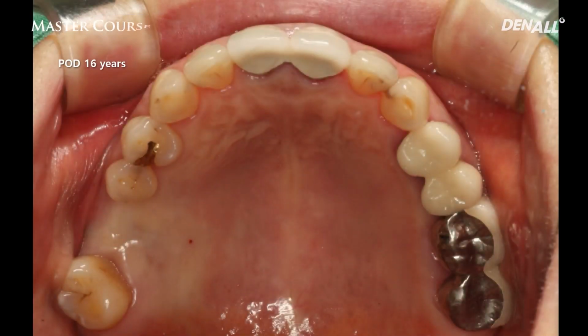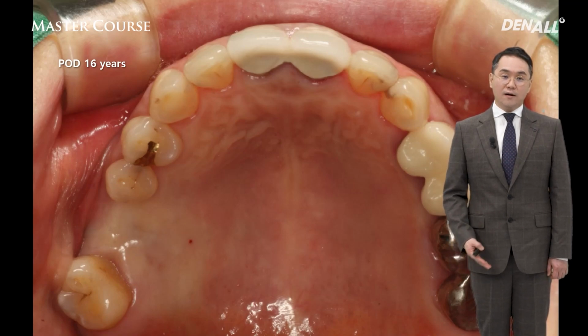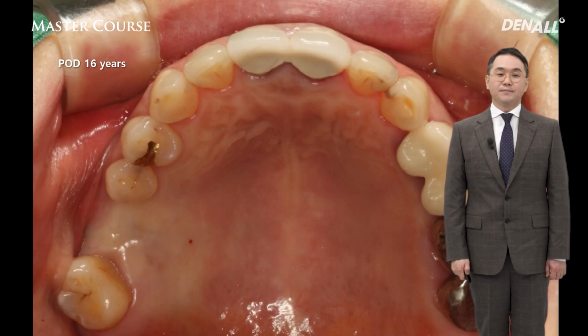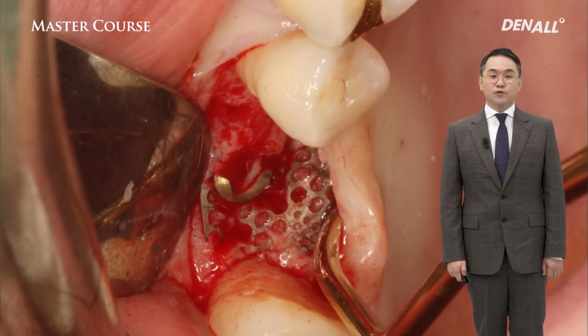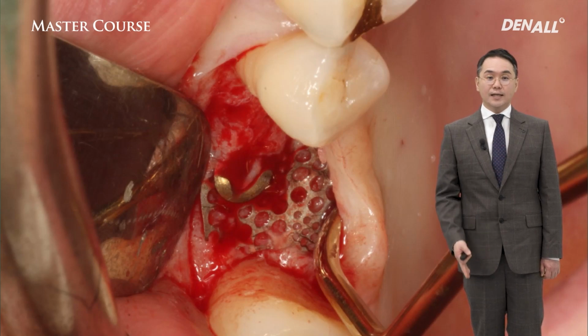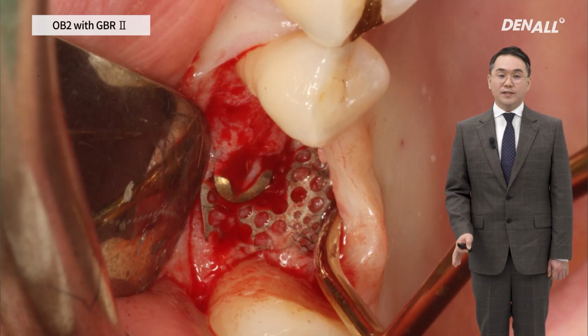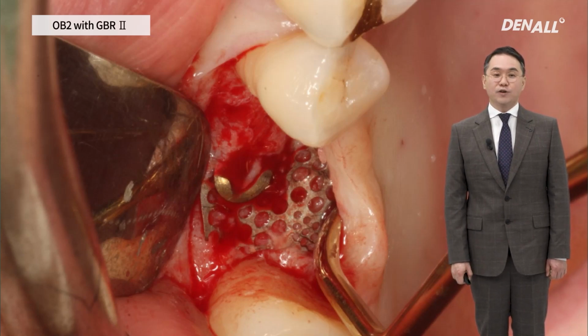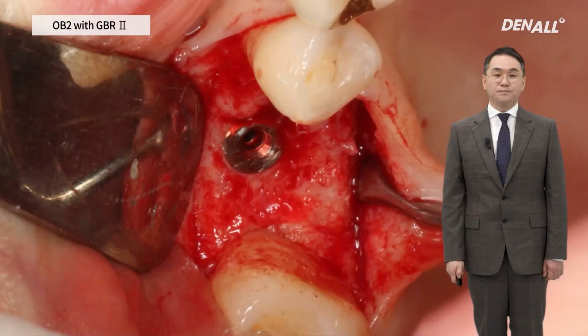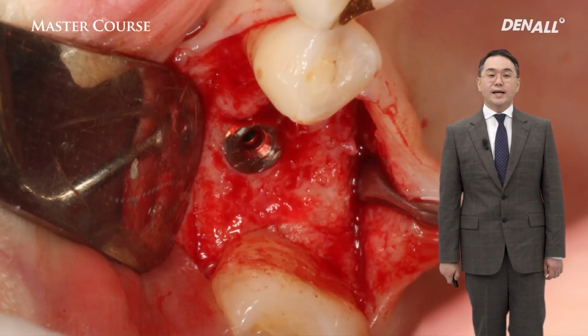This is 4 months after surgery. Soft tissue has healed nicely. Ossbuilder cover cap are not exposed at all. I opened the flap and did secondary surgery to remove Ossbuilder. As mentioned earlier, even if you have submerged it, you don't need to make vertical incision. You can just make crestal incision, open flap, and on the palatal side, superior to the Ossbuilder, I open flap slightly more. I remove the cover cap and remove the Ossbuilder.